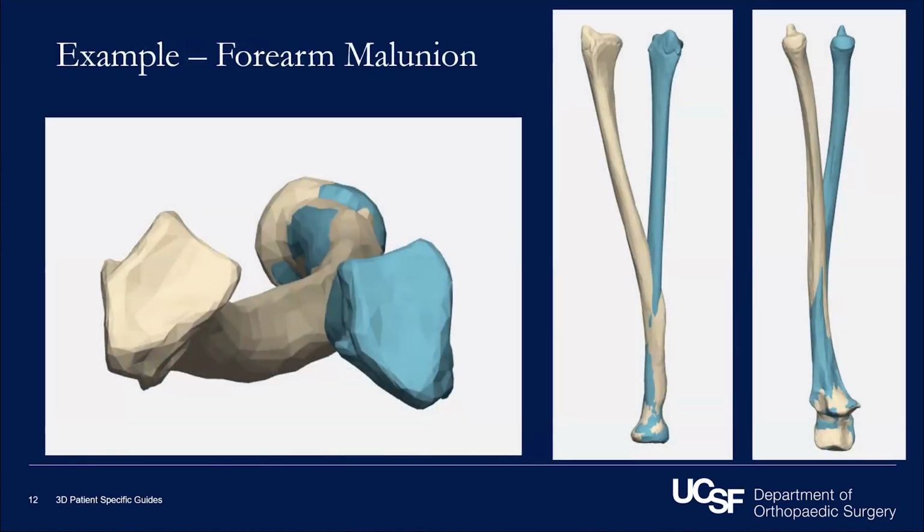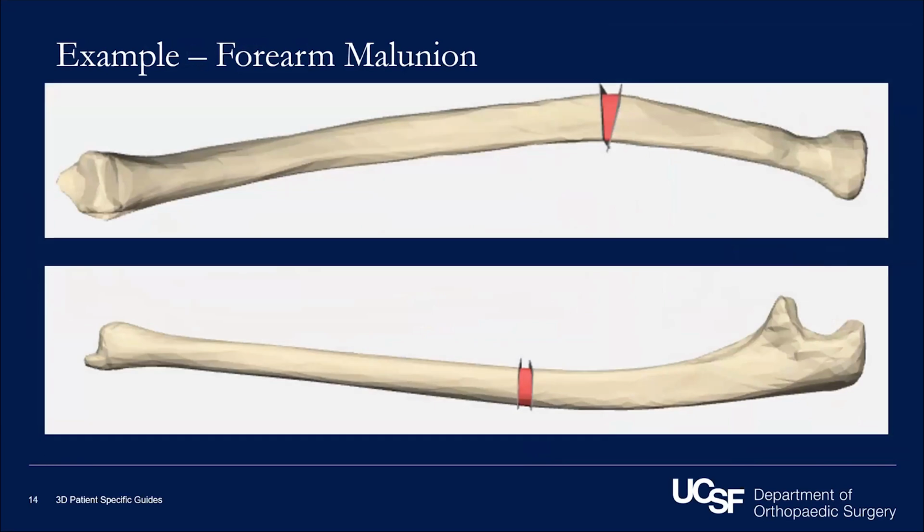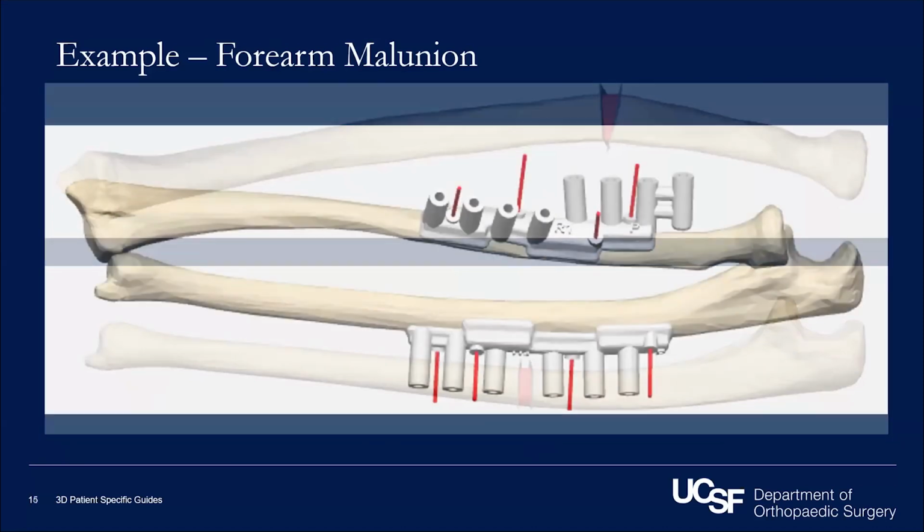So here's that example. Here's the forearm malunion. Here's the radius, and you can see there's angulation and also rotational difference. And here is a simulation of rotation that shows bony impingement and limited supination that the patient gets. And we can design the osteotomy. So we're fixing the correction to align to the contralateral limb.